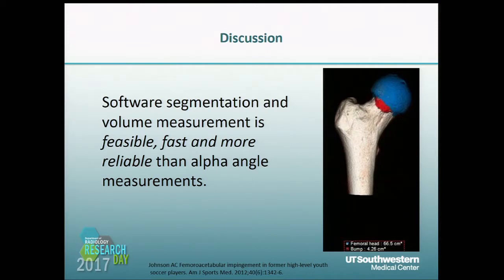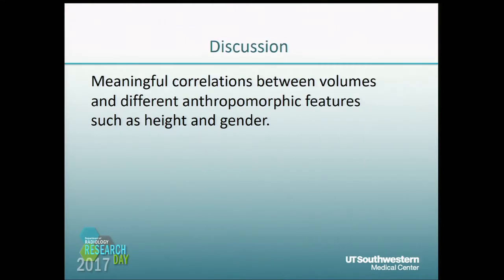Drawing the ROI is actually pretty quick and easy to do, and as you can see here, pretty reproducible. Additionally, we found a significant positive correlation between height and the size of the CAM lesion, and this stayed true when we separated out by gender. Finally, male patients have larger CAM lesions than females do, and this could have treatment implications. If they know they're going to have a larger CAM lesion, they might know they have to do more invasive grinding off of that bony prominence in surgery.